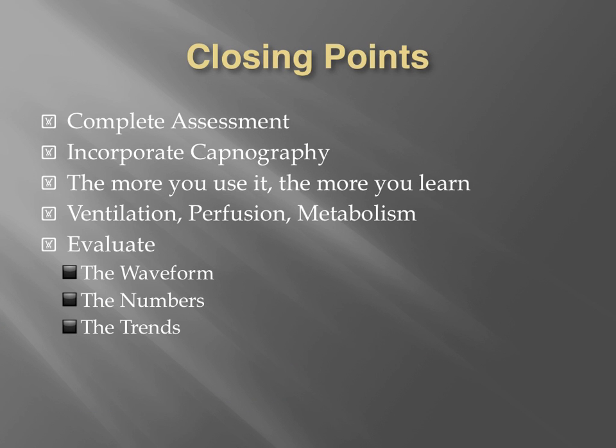So that wraps up our waveform analysis for today. That won't be the last time we see our waveforms though, because remember, when we evaluate the patient, we are evaluating the waveform, and we're evaluating our numbers or our levels, and we're also evaluating our trends, how that waveform and those numbers look over the course of time. Remember that we need to do a complete assessment with our capnography, and that would include incorporating that capnography and looking at all the things that we're attempting to teach you today and in past and future episodes.